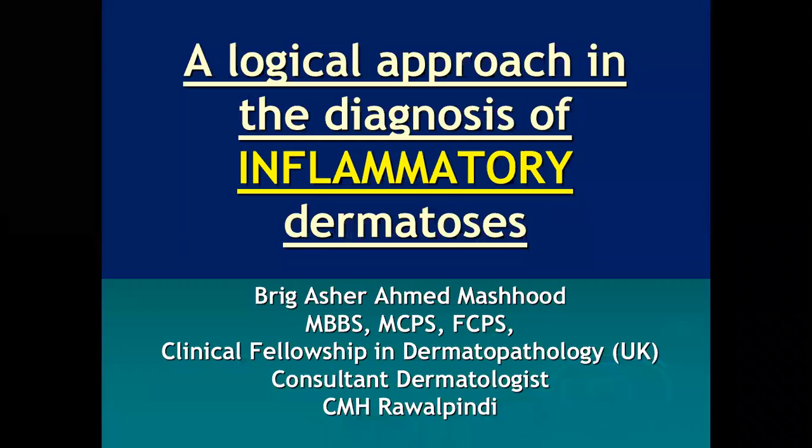Dear students, the topic of today's lecture is a logical approach in the diagnosis of inflammatory dermatosis. I gave this lecture at the start of my lectures during Corona lockdown, but at that time I did not record it. So I considered it appropriate to again deliver the lecture and this time record it so that you can see this lecture again and again.